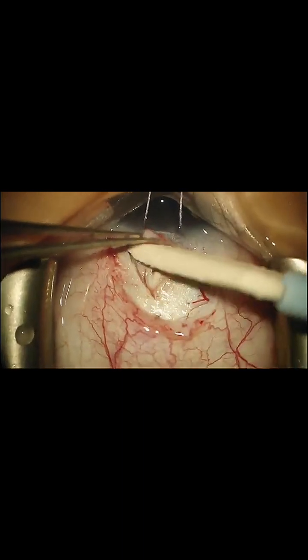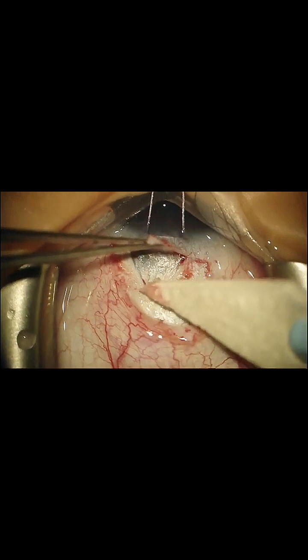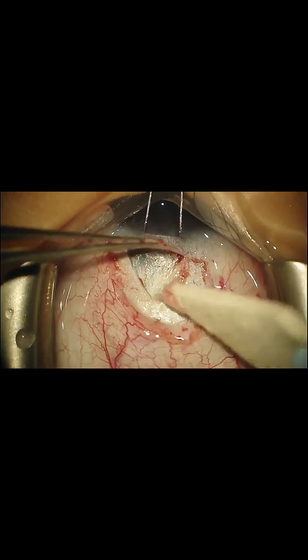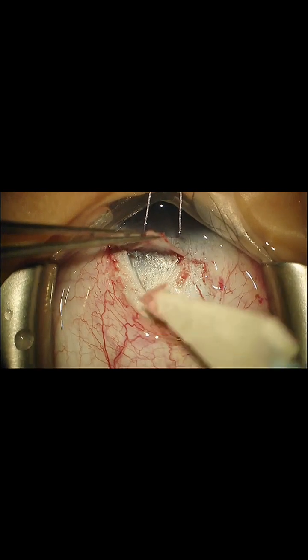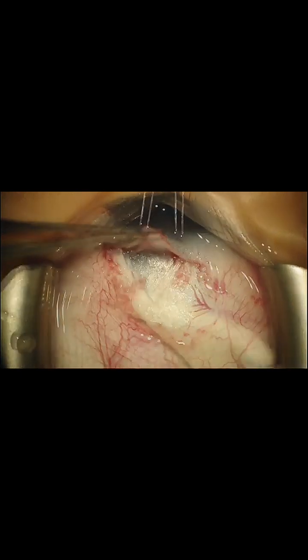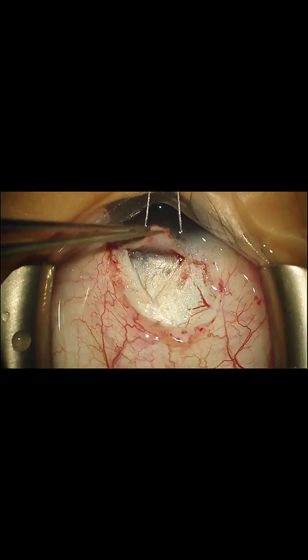So some of the landmarks that we're looking for here, sometimes you'll see little bleeding vessels. I think there's one right here at the tip of the spear. Those are typically little vessels draining Schlemm's canal. There's one right there. Okay, so those are draining from Schlemm's canal. So I like to see those. Those tell us about where we want to be.